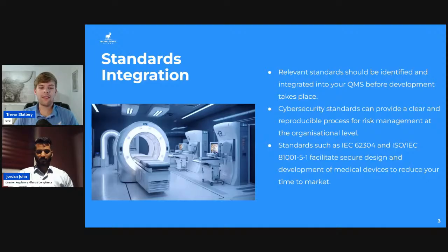All right, now the first thing that I want to talk about before we get into the actual standards is how we can integrate these standards. So, relevant standards should be identified early into your quality system before development takes place. And what that means is, as we're starting that design process, as we're starting the development process for the medical device, we want to figure out what standards are going to be relevant. How can we prepare for these early and often?